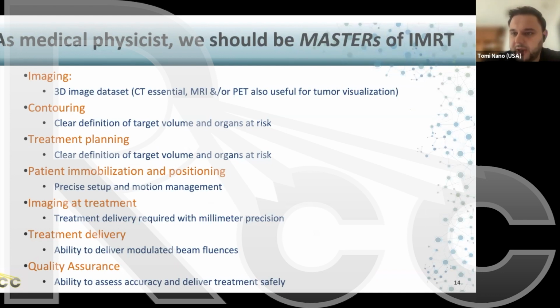Yeah. So typically IMRT VMAT is higher MU. And that's because you're not shooting an open field. So you're not delivering that much dose, you're conforming it, and you tend to deliver it in small amounts at a time so that you can deliver it more accurately to shape. Yeah. So we'll come back to that.